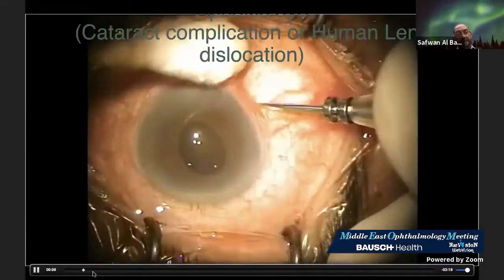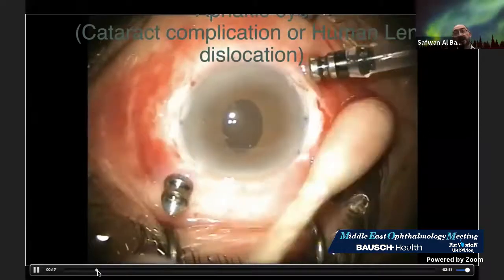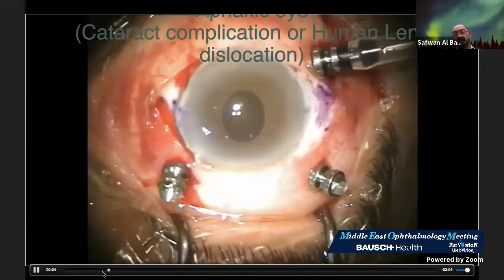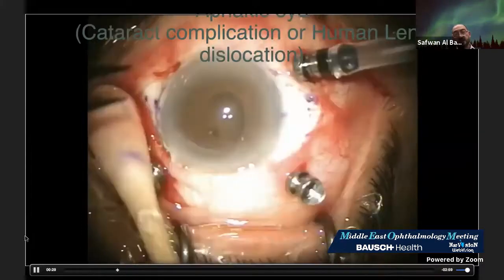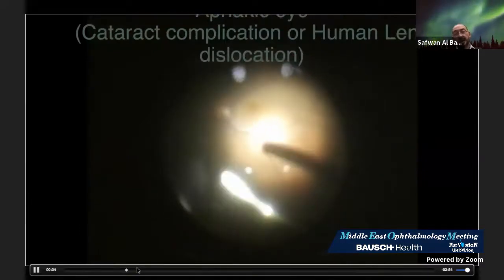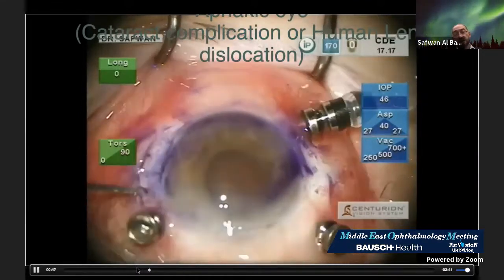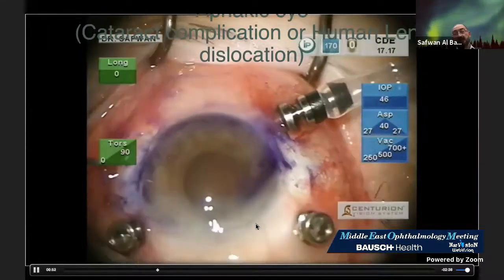This is a vitrectomy. We can skip it for this side, and you can see the sclerotomy, sorry, the peritomy. The marker is very clear at 3 and 9. 2 millimeters from the limbus, 3 millimeters away from each sclerotomy here. Now, MVR through the sclerotomy to prepare it. I'm seeing the end of it for each. And then the main incision is opened. It's 2.2.